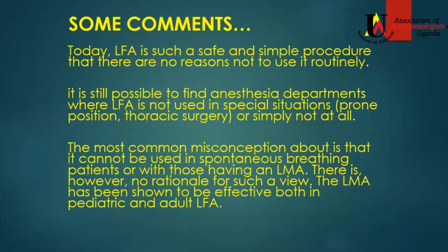Okay. So a few comments here. Low flow is such a safe and simple procedure that there are no reasons why we shouldn't be using it routinely. It is still possible to find anesthesia departments where low flow is not used in special situations, especially when you're doing prone or thoracic surgery, or not at all, because people are not aware of the technique, or people have not been trained in it. The most common misconception is that it cannot be used in spontaneously breathing patients or with those having an LMA. And we said LMA is actually much better because it doesn't bypass the humidification.